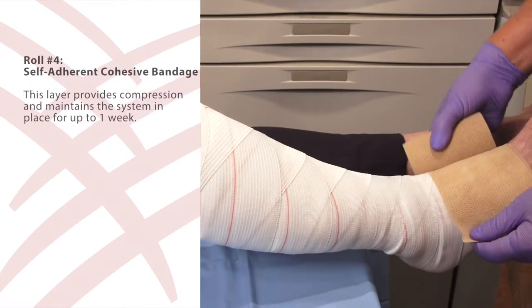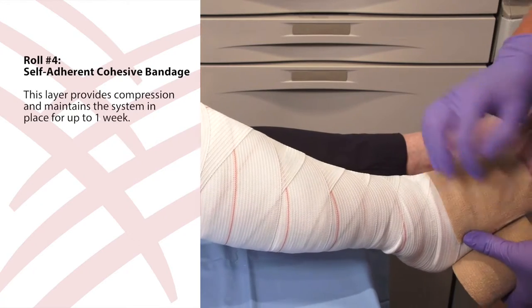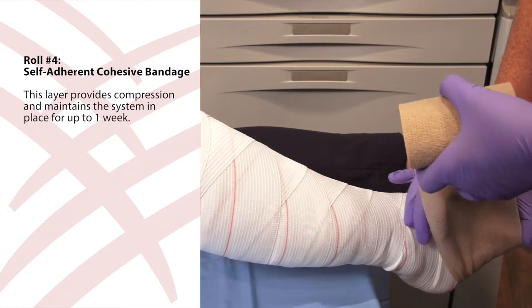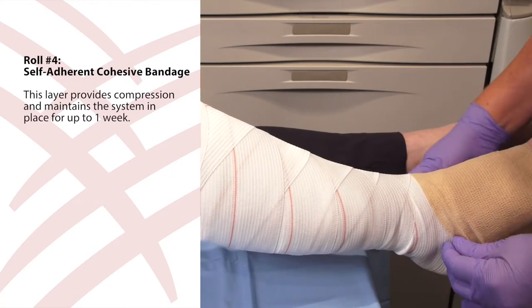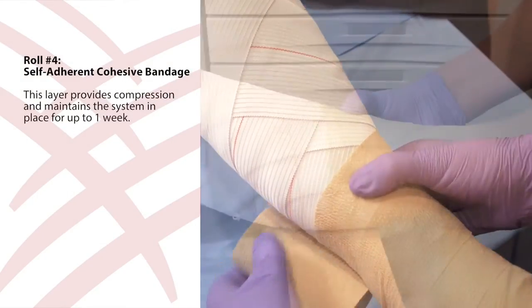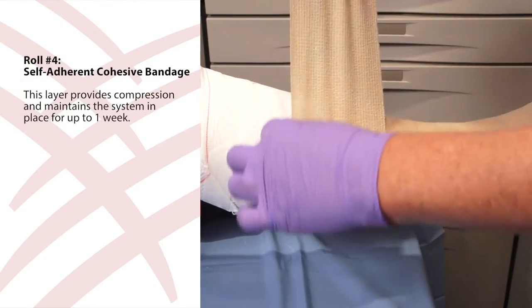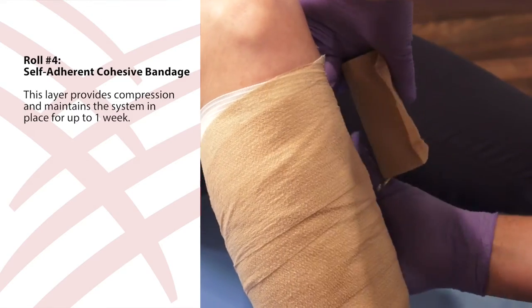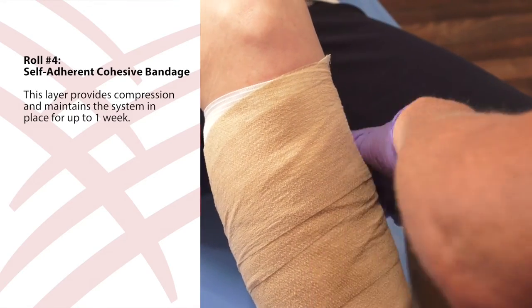Finally, use roll four, the self-adherent cohesive bandage. Starting at the base of the toes, anchor the bandage with two wraps around the foot. The self-adherent cohesive bandage applies compression and maintains the system in place for up to one week. Work up the leg using a 50% overlap. Cut the bandage, ensuring it is not stretched at the last 15 centimeters, and secure by pressing lightly.